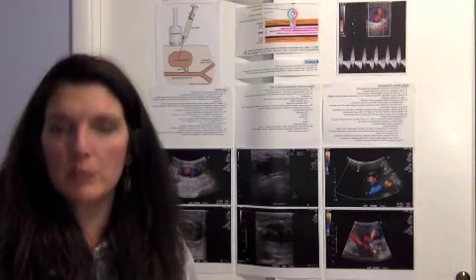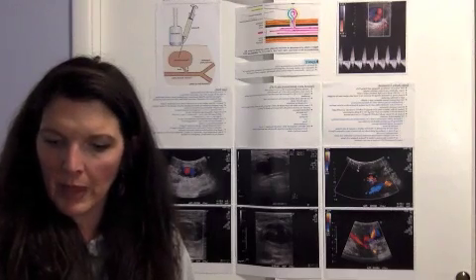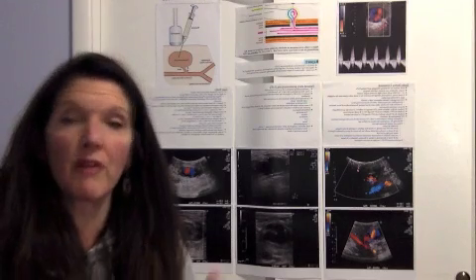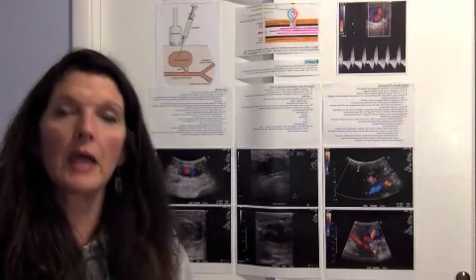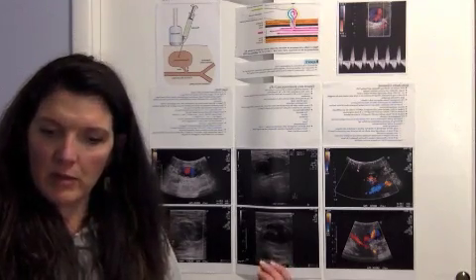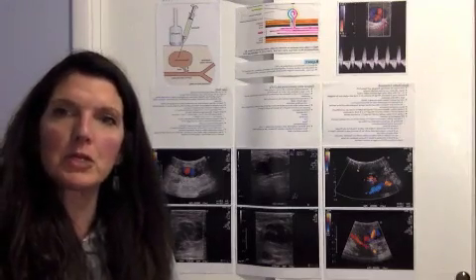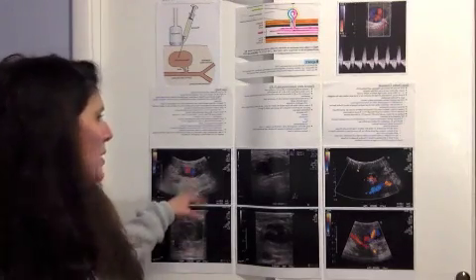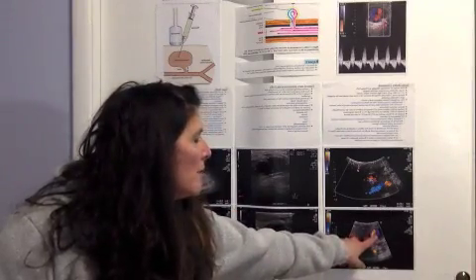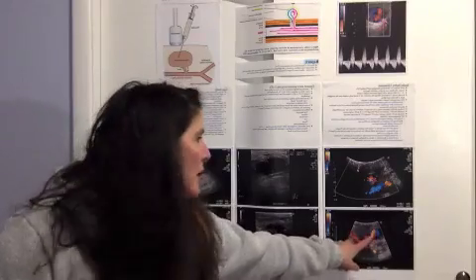The patient was released from the hospital and ordered for a 2-week follow-up with one of our vascular surgeons and another groin Doppler ultrasound. When she came back for that procedure, we also noted a multilobular pseudoaneurysm, which is right here in this picture.